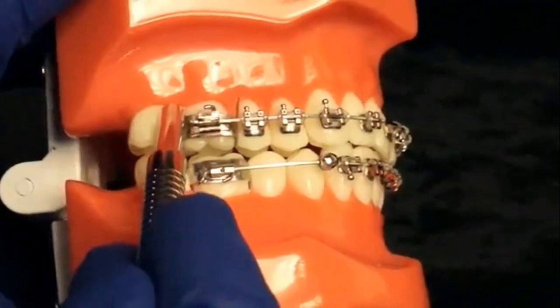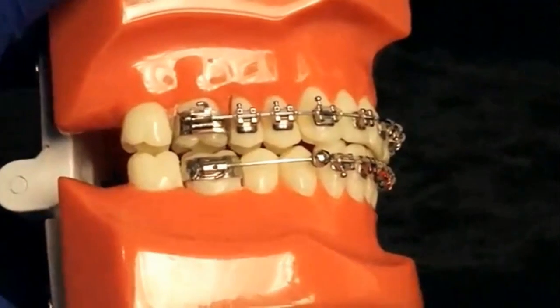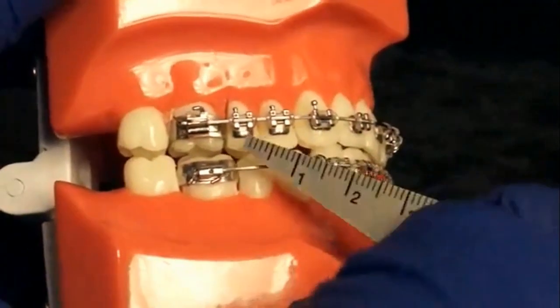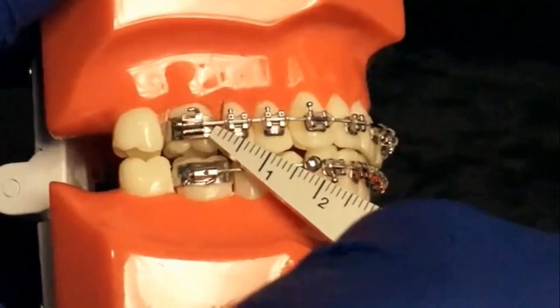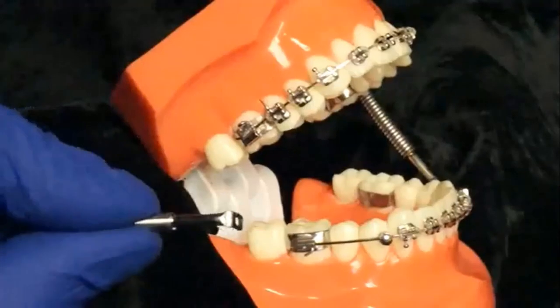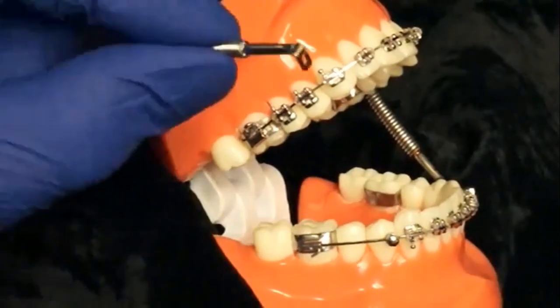So we are just deciding what should be the length of the spring because we want to advance the mandible. It is an end-on molar relationship and I want it to become Class 1. So we are measuring the advancement and accordingly I am going to decide the length of the spring I will use. So that's the spring you can see on the other side already, and this is the other side.